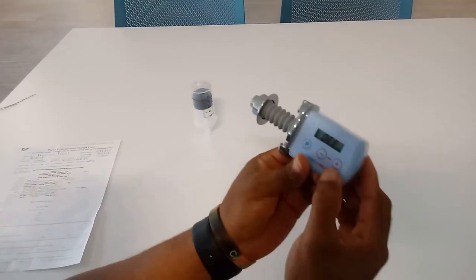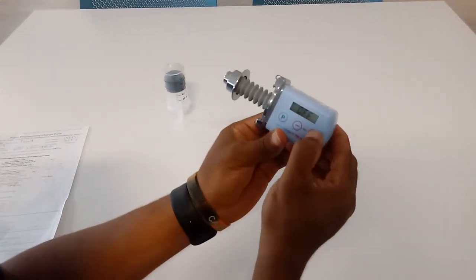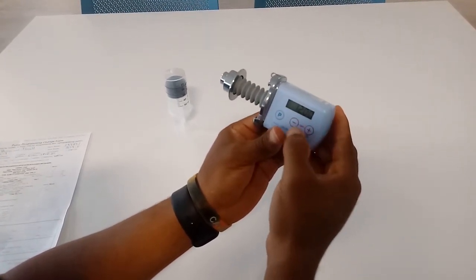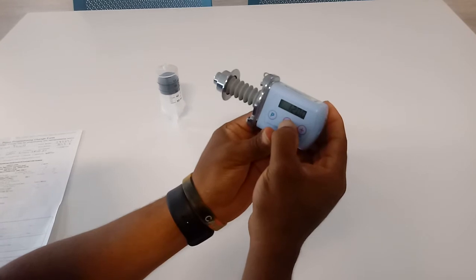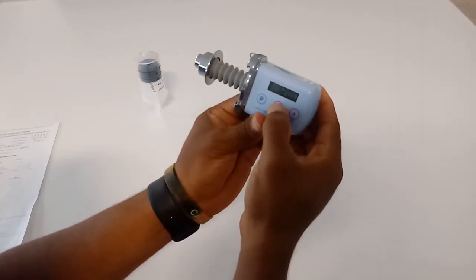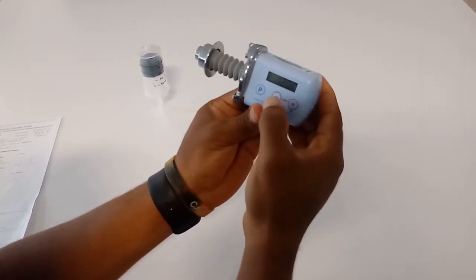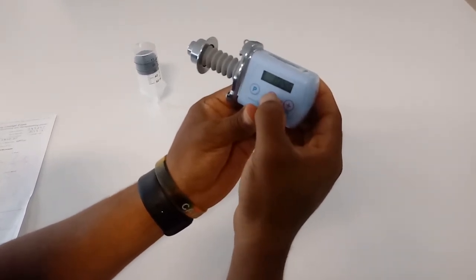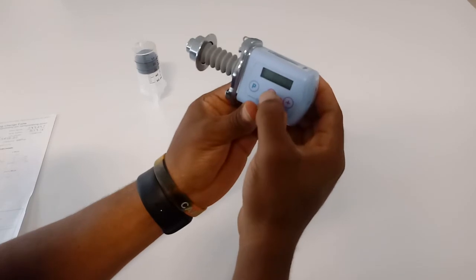Actually, our patient needs 10 hours. So we're going to turn the pump on. So I just want to see if you guys were aware. You see 12 cc's for 12 hours. So now we're going to hold this button. Okay, now it's blinking. We're going to hit it. And again, we go down to the desired time that we want. So now it's 10 hours.